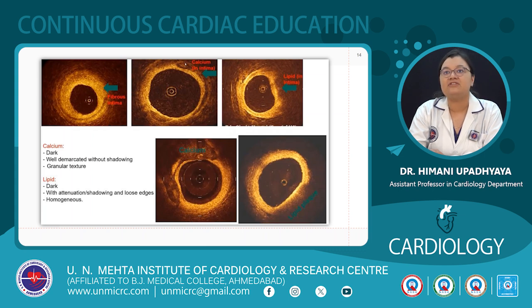In the third image we can see low backscattering and high attenuating lipid in the intima, and in the fourth image we can see clearly sharply defined low backscattering and low attenuating calcium. In the fifth image we can see a plaque with heavy lipid burden, that is very likely a vulnerable plaque.